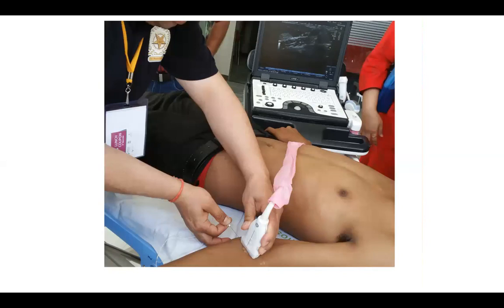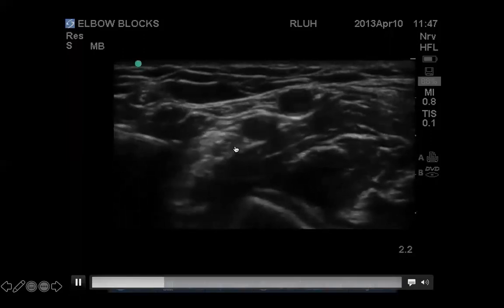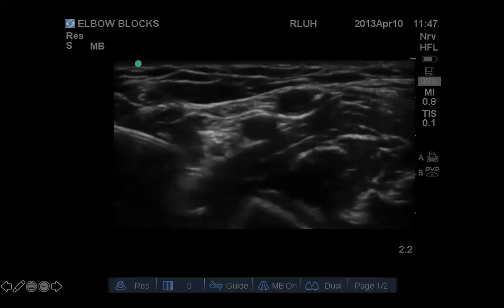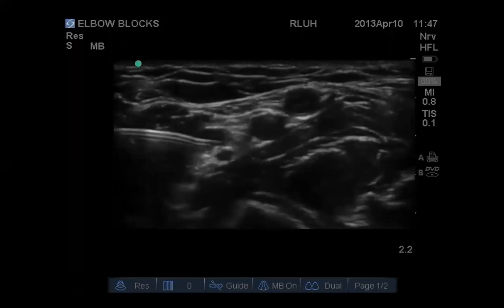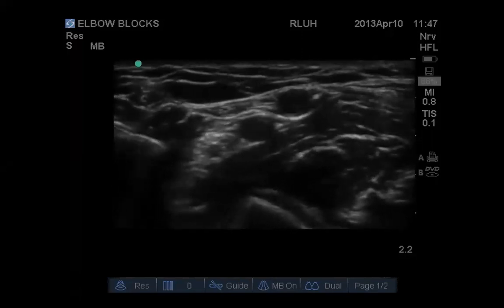For the ultrasound-guided median nerve block, this demonstration is on a volunteer — not an actual block — just showing needle approach from the medial side. The probe is in the cubital fossa; you look for the brachial artery and go medial to it. You can see the artery pulsating, with the nerve lying just under it. Local anesthetic is deposited just under the nerve and spreads around it. Be careful not to perform an intra-arterial injection, as a vein also lies on top of the artery.